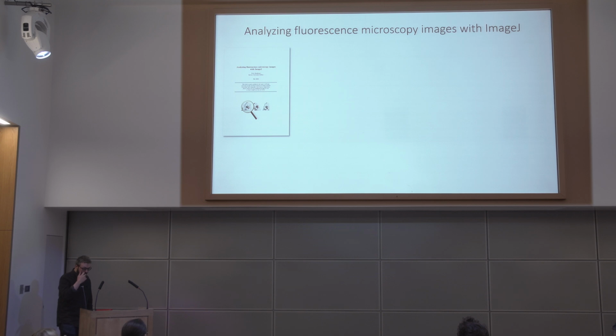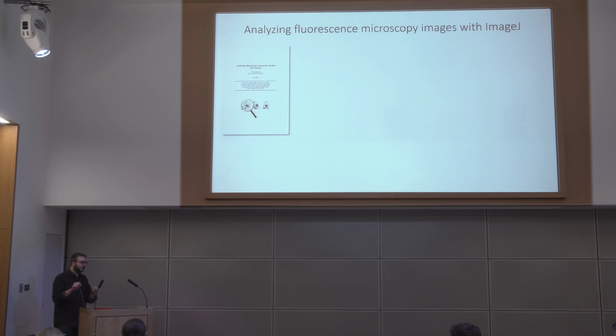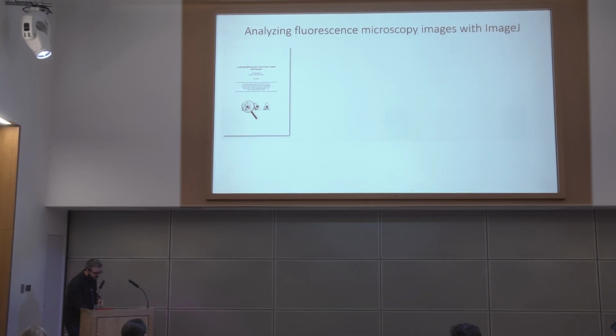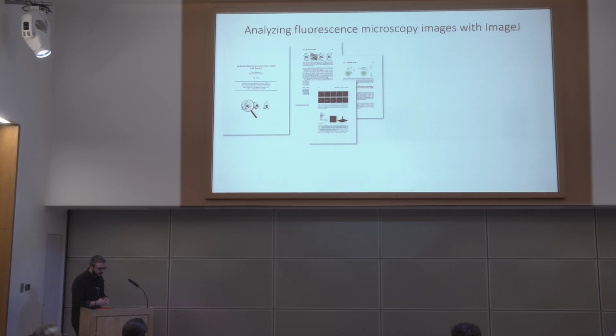So while I was in Heidelberg, one of the things that I discovered is that lots of people were coming with similar sorts of questions. And I thought that I could try and answer all these questions individually, but I'd probably give better answers and help more people if I can try and explain these concepts in a broader way. And so I wrote this image analysis handbook, thinking that I could probably write about 20 pages and that would describe everything that you would need to know, but it ended up being a bit longer than that, either because there was more to know or I was a lot wordier than I intended to be.